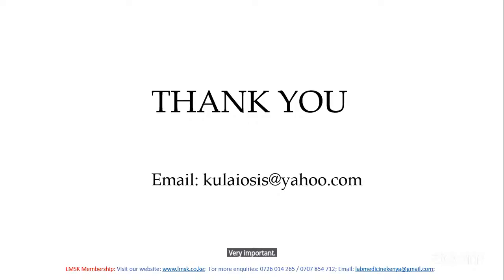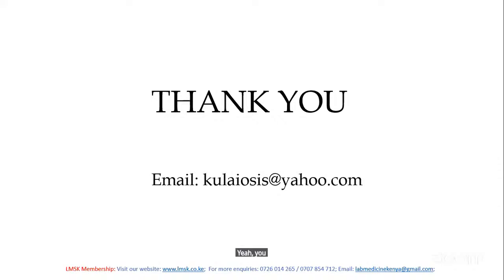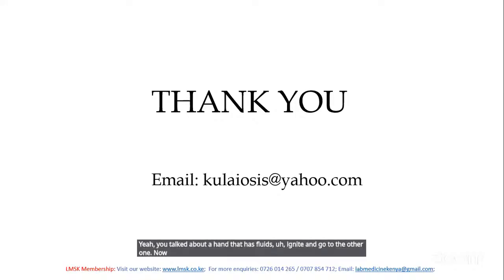Martin Mutunga: In case you have both hands of the patient under infusion fluids and you're supposed to collect blood, which is the preferred site for that matter? You talked about the hand that has fluids, ignore it and go to the other one. Now, how about when both hands are used?